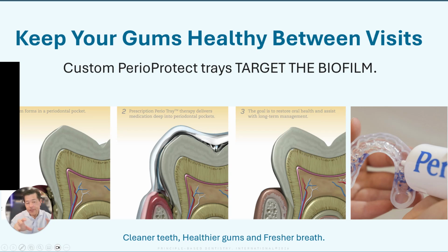This tray fits so tight, it squeezes the gel into the sulcus and into the interproximal areas of the teeth, right? It's not going to be like an Essix or a bleach tray that just allows the gels to sneak out around the edges. This is going to hold it and squeeze it into the interproximal spaces of the teeth and into the sulcus.